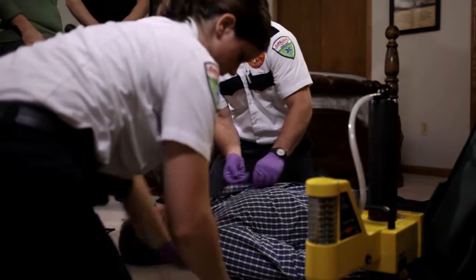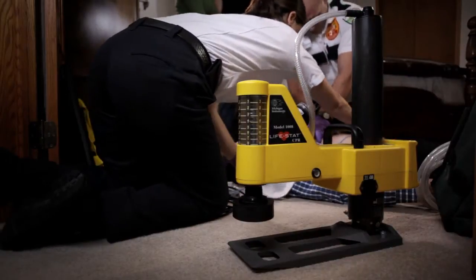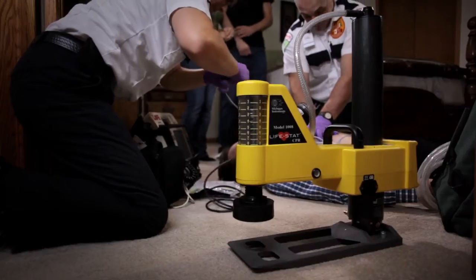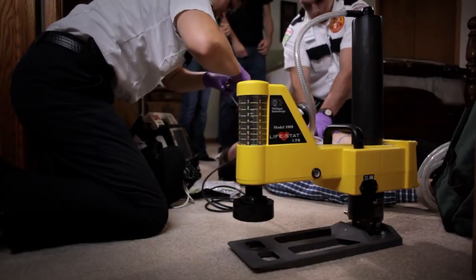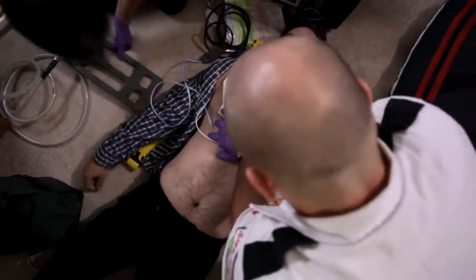The Life-Stat Hands-Free CPR system provides cardiopulmonary resuscitation in accordance with current American Heart Association guidelines and can be updated should those guidelines change. Setup of the Life-Stat is quick and includes an integrated ventilator that connects to your existing oxygen system, giving nine asynchronous ventilations per minute.